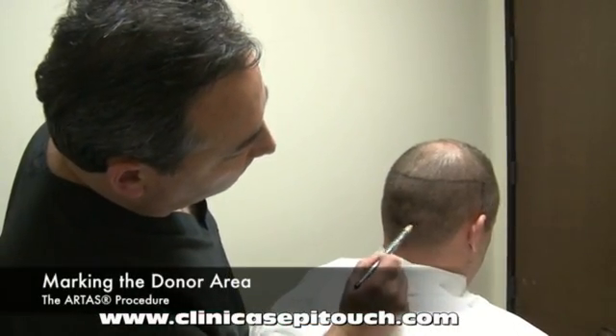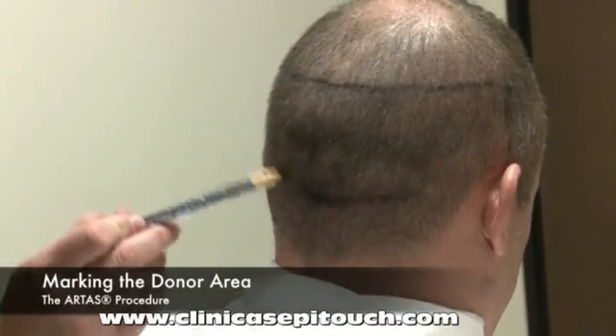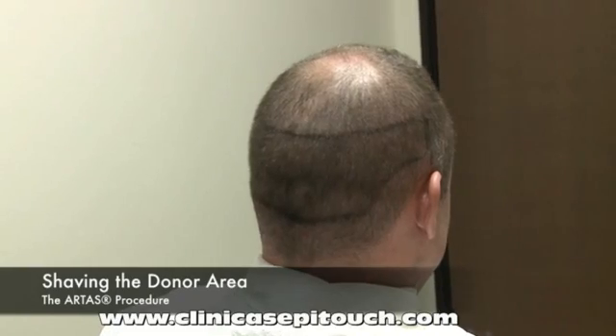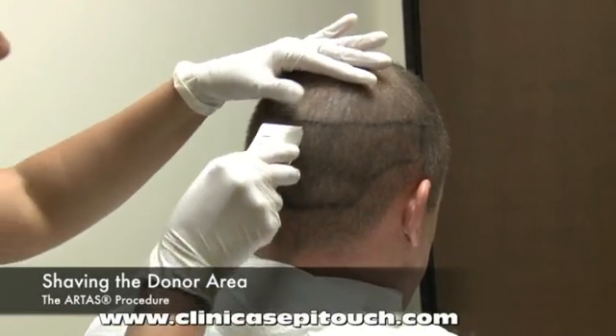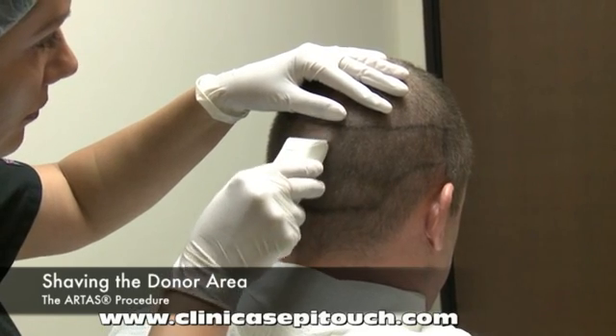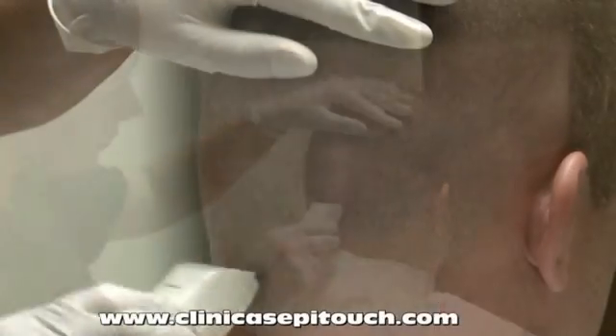To begin, we need to prepare the donor area, and we'll start by marking out the region from which follicular units will be harvested by the system. Next, the donor area will be shaved down to a length of 1 millimeter. 1 millimeter is the optimal length for the system to identify, track, and dissect follicular units.